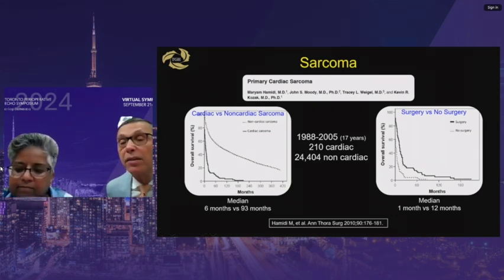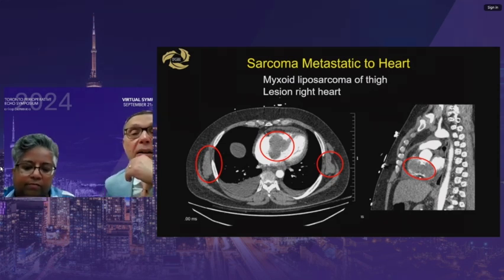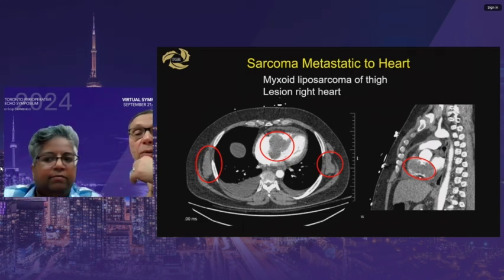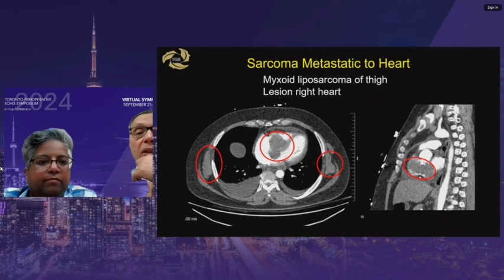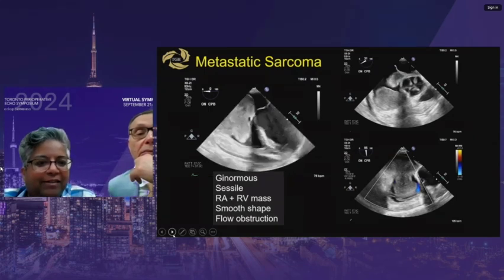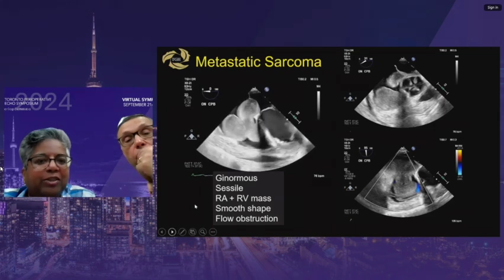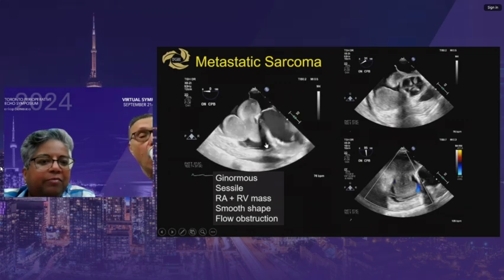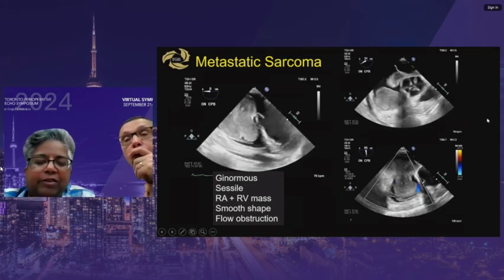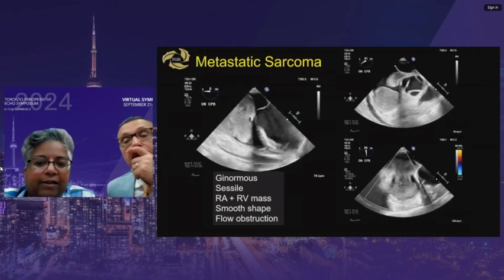A case of metastatic liposarcoma of the thigh extending into the right heart causing obstruction and impending death — one of the rare instances where primary cardiac resection is warranted if there's reasonable expected outcome otherwise. The tumor is described as 'ginormous' — gigantic and enormous. On echo it resembles a myxoma, attached to what looks like the interatrial septum, obstructing the tricuspid valve and filling the RVOT. Color Doppler shows very little flow through the heart. Femoral bypass was established — filling the patient and placing in Trendelenburg to try to unblock the right atrium before going on partial bypass.